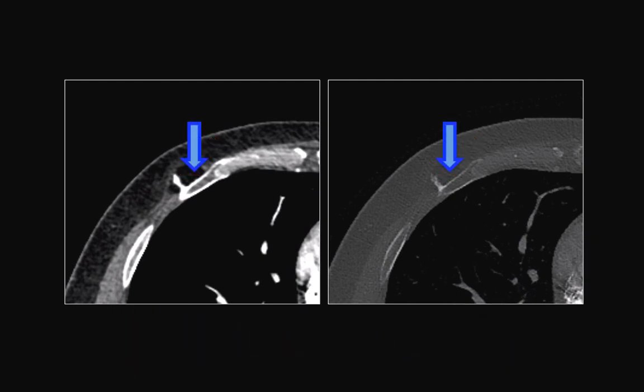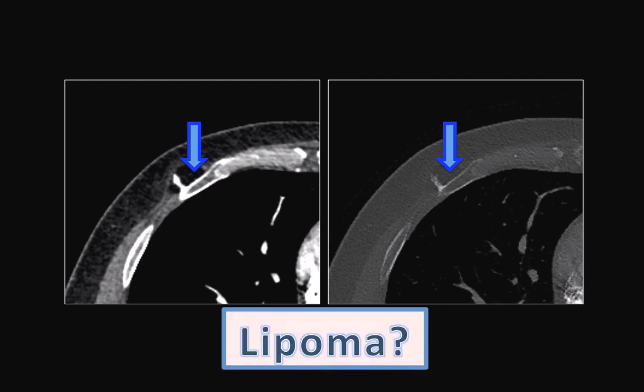Additionally, you see a well-encapsulated lesion of fat attenuation surrounding this bone spur. This could be a lipoma.